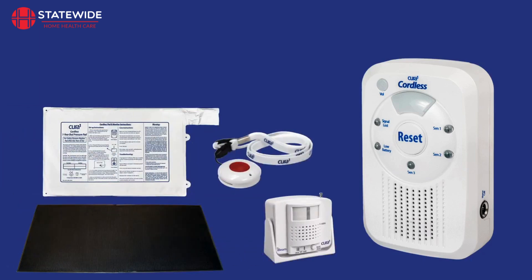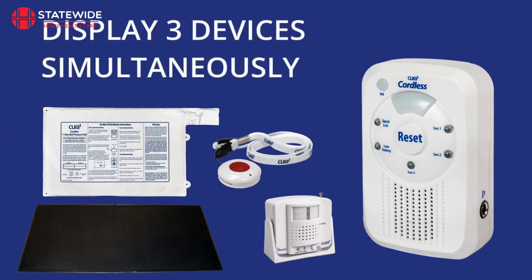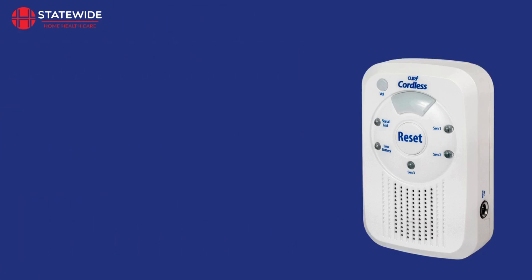The monitor can be programmed to pair with up to 3 devices that can be displayed simultaneously. When the monitor receives an alarm signal, it will illuminate and sound an alarm.